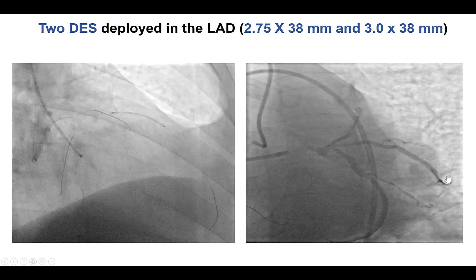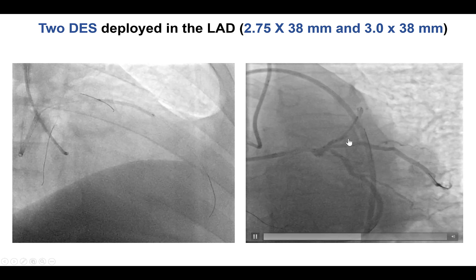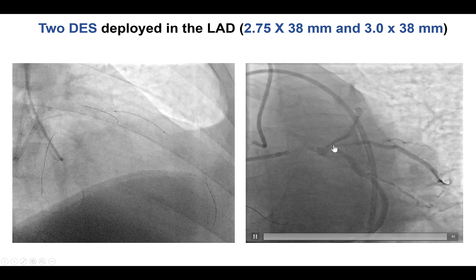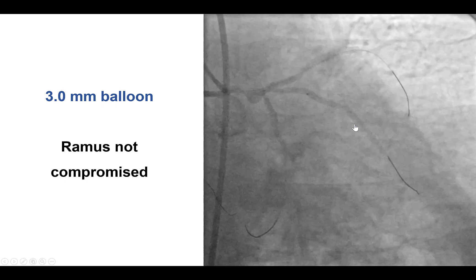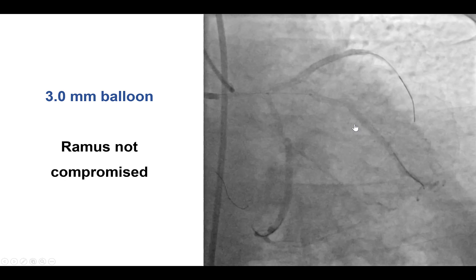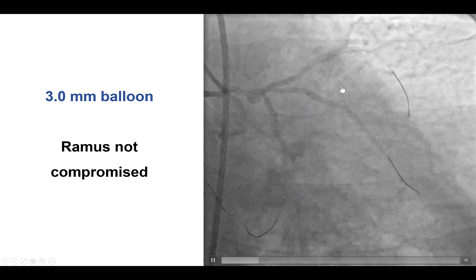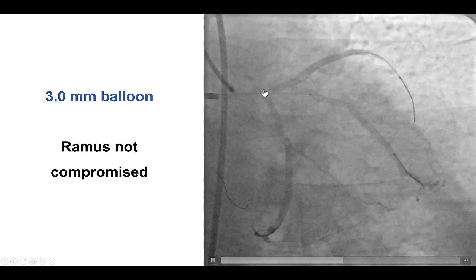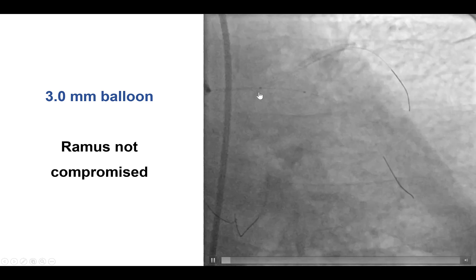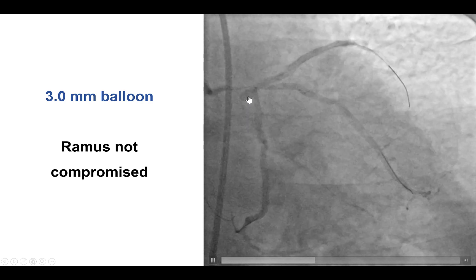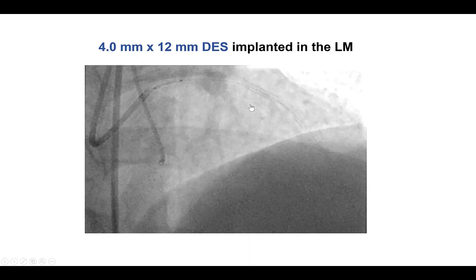We performed IVUS, which confirmed that we were actually within the distal true lumen, and then placed stents all the way from the ostium of the LAD into the mid-LAD, restoring flow without compromising flow in the ramus branch or the circumflex. Of note, we had to intermittently disengage the guide catheter to avoid deep engagement and ischemia, given the significant left main lesion.